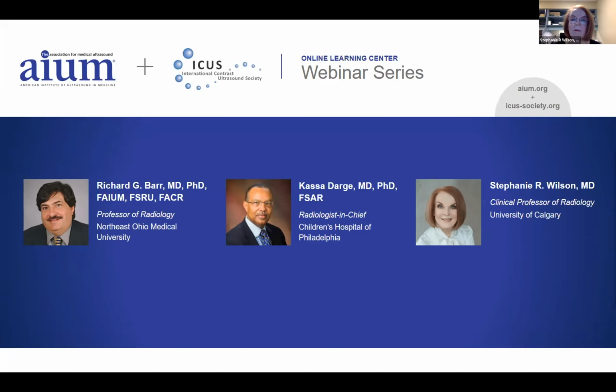Yeah, but good. Now, someone asked us, does anyone have colleagues in emergency medicine that use CEUS in the emergency department with POCUS? I'm not sure if anybody would like to answer that or not. Yes. I'm throwing it out there. Yes. Actually, on my first slide, the names of our ED colleagues were included.